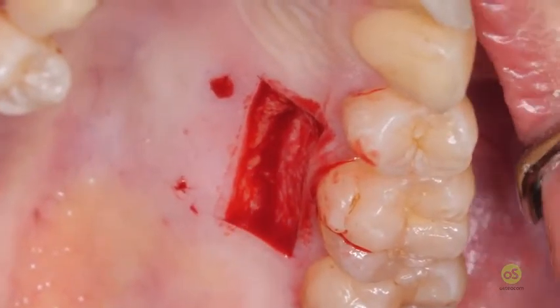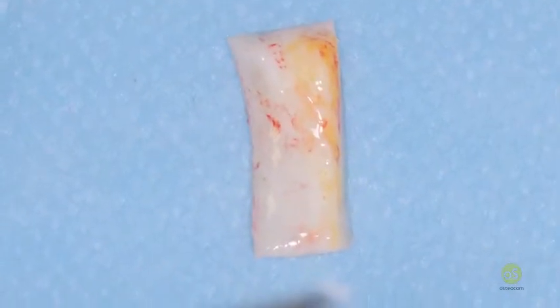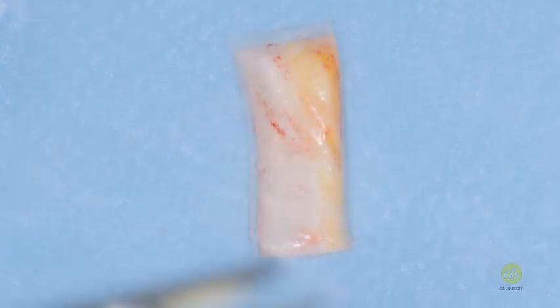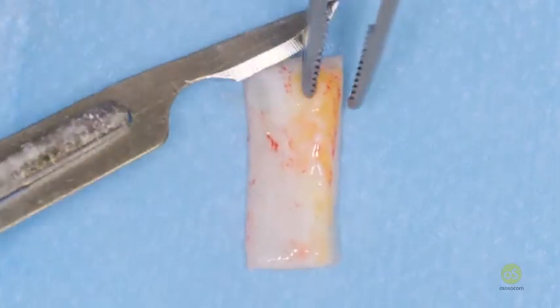Now don't close it immediately, don't lose time. Ask your assistant to keep the gauze in protection because it's not bleeding at all. What do you see yellow? It's stem cells. So I keep these stem cells and I will use them for something that is more useful than a connective tissue graft.